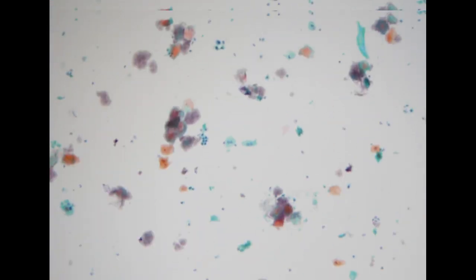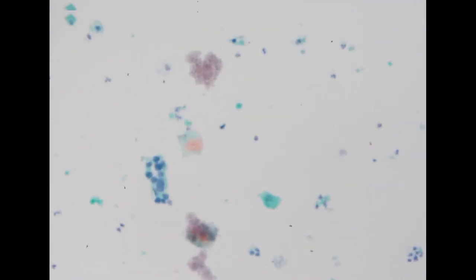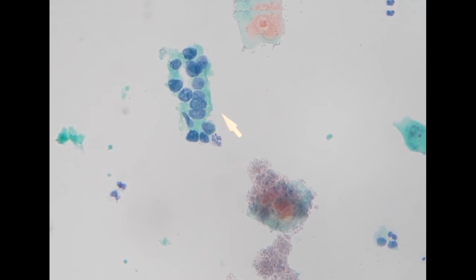So when we screened the case, we noticed on medium power there were some smaller cells with scant cytoplasm and increased nuclear hyperchromasia. The specimen shows significant drying artifact, so the chromatin pattern is not very well preserved.